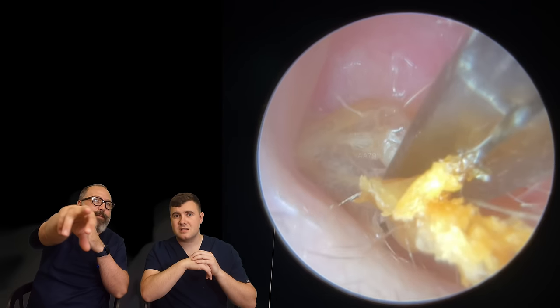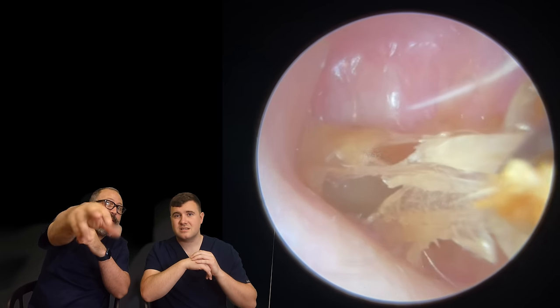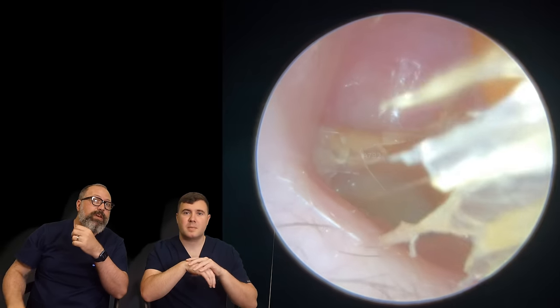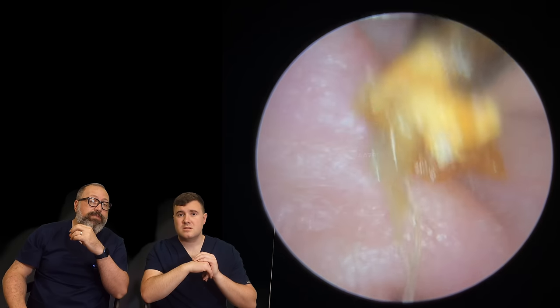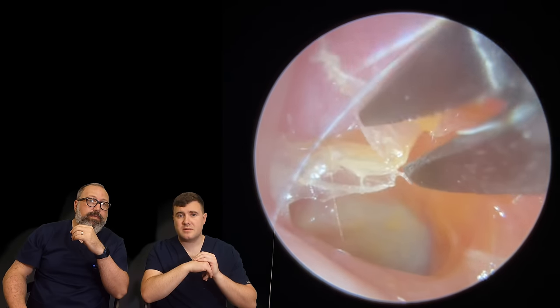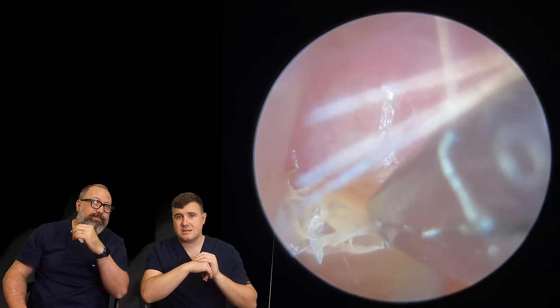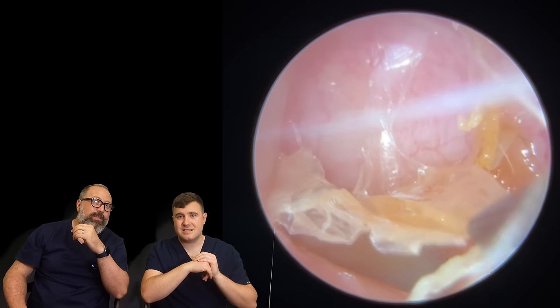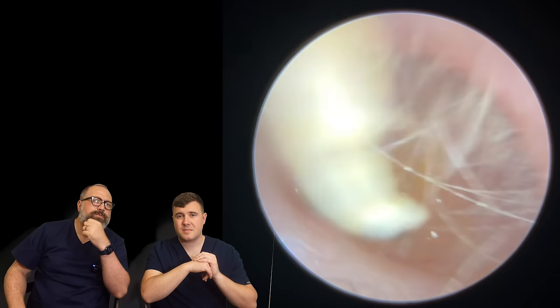I've got to be honest — it wasn't until we started pulling it that you could see it. A little bit left there. Is this going to peel or is it going to shear? Look at that peeling away there. That hole is still holding on quite technically. You can see almost like little fine spider webs of skin holding on to the top section there. A lot of olive oil got in now — fine end on here. Let's see what we're dealing with. Look at that, it's just peeling from everywhere. These are very tricky to do sometimes because you can't even see it. I think if you were using just a general auroscope or otoscope, you wouldn't have seen that blockage to start with, and you wouldn't have seen this beyond it. This is where the endoscope is a really good tool, especially with these peels.